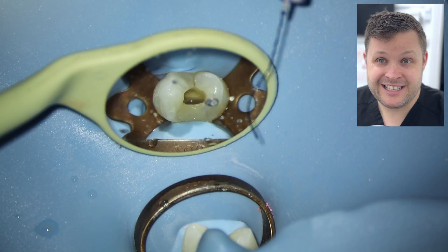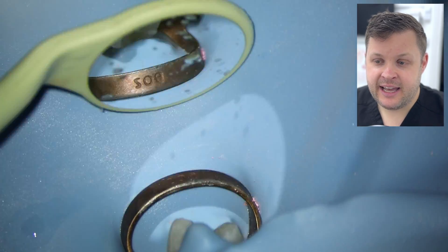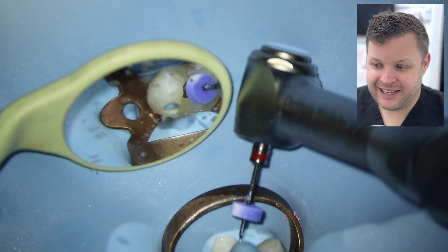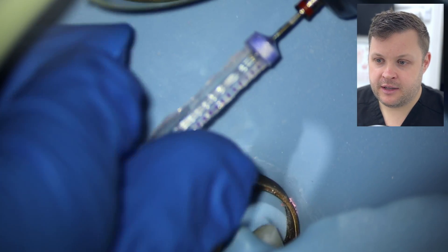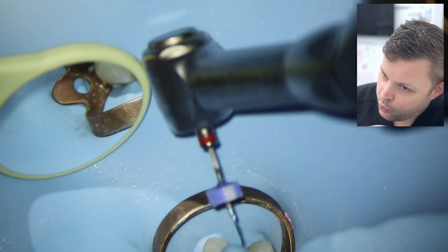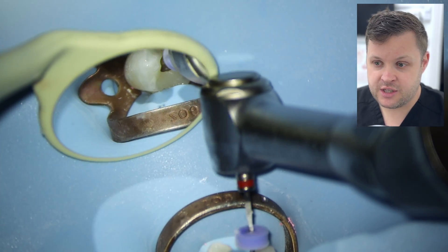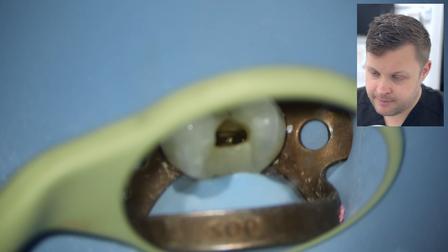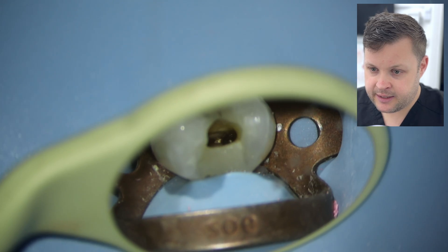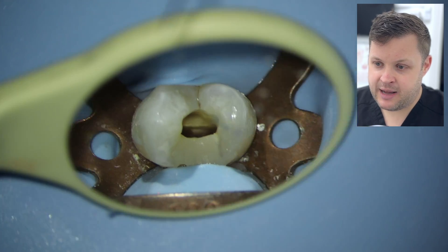The reason we cool the file and straighten it is so we can get it into the canal — it's almost impossible to insert a bent file. It took me multiple attempts to get it inside the palatal canal, which was very frustrating, but eventually I slipped the file in. The significance of the crescent-moon shape is that it scrapes the walls, removing remaining GP. Most of it is removed; just one tiny piece remains. I try to irrigate it out, but can't quite reach it with irrigant.